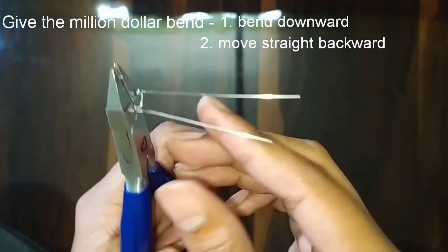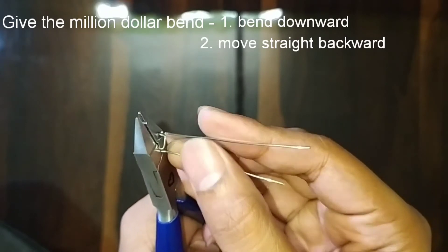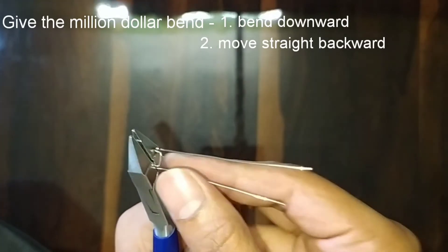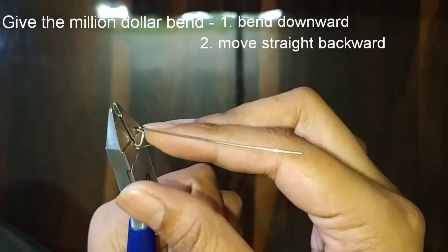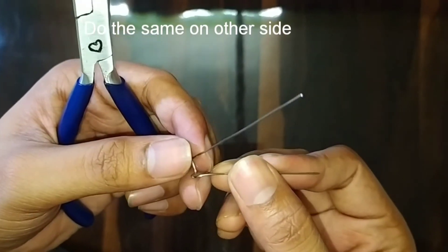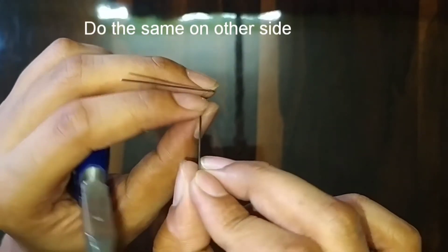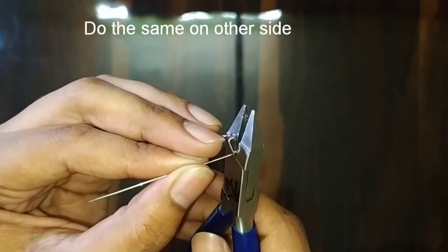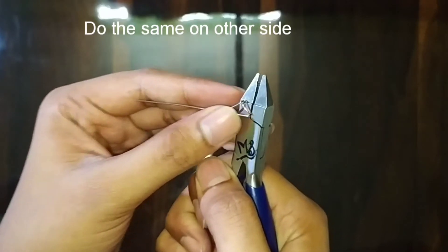Hold the arrowhead from the point we have marked tightly with the plier and follow the simple procedure: just bend it downwards, then move it straight backwards — downwards and then backwards. We can see how this bend is looking. Similarly, follow the simple steps on the other side — hold it tightly and just bend downwards and move backwards.